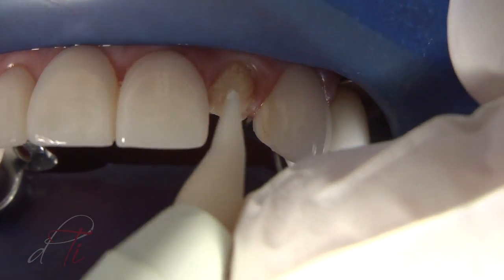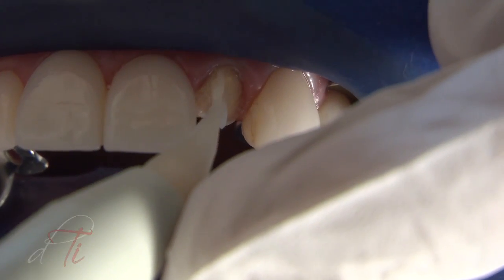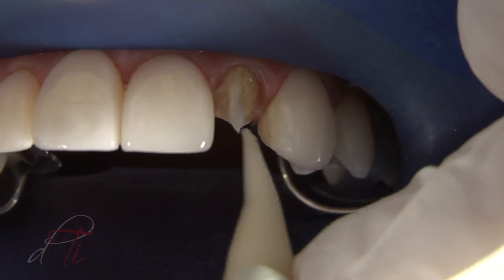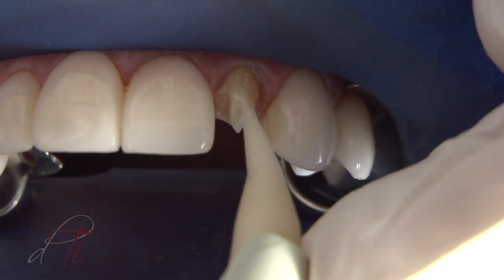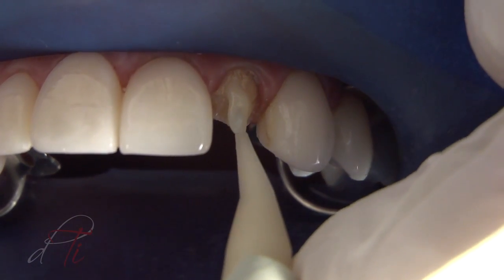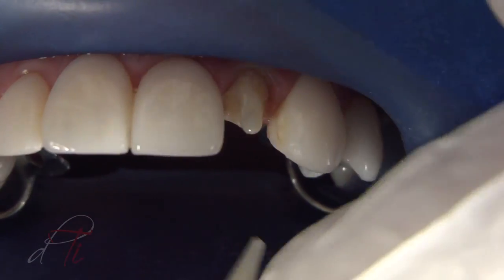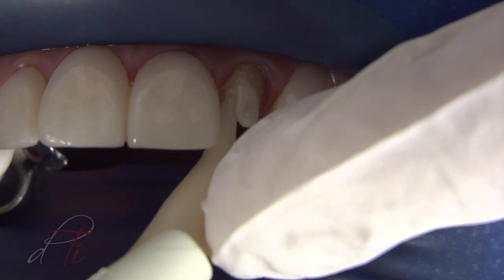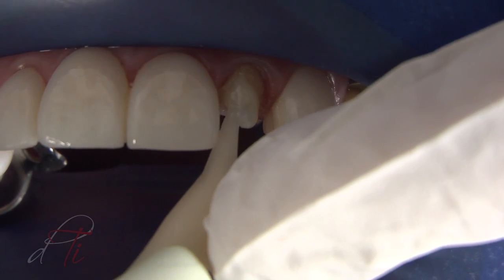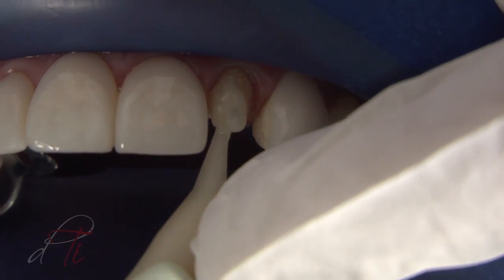A dual-cured, radiopaque composite core build-up material, Rebuilda, is injected with a syringe tip and Accudose low-viscosity bicentric over the coronal aspect of the post from the facial and lingual aspect. The opening of the syringe tip is enlarged using an explorer tip. Notice the material maintains its form and is very sculptable — a very important characteristic when freehand bonding without using a matrix.